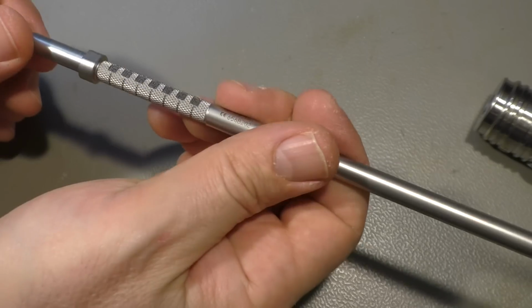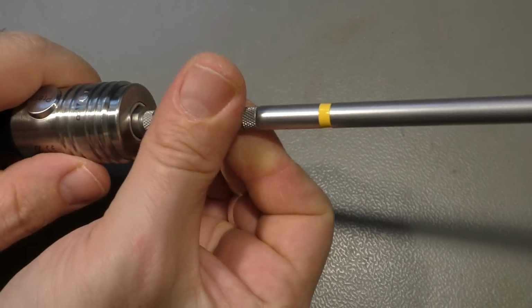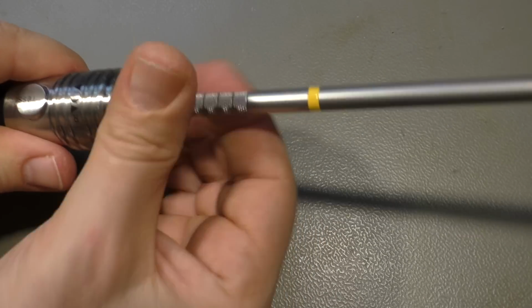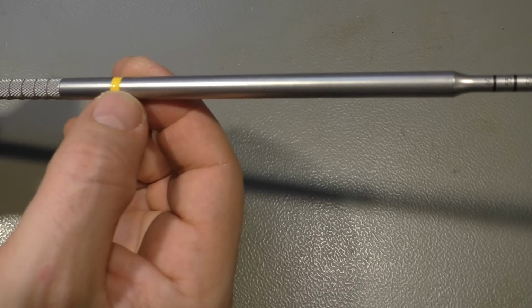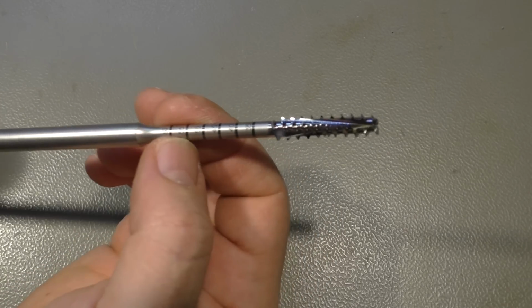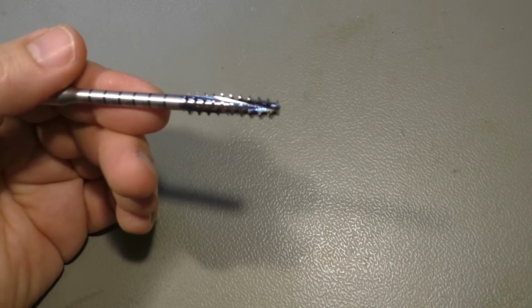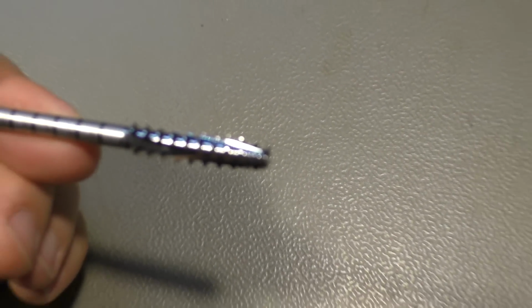Then we have these tap drill bits. They go also into this thing. And in the center position it is locked on both sides. Has a yellow marking. The others are blue, green and violet. It has a depth gauge here up to 60 millimeters. And we have, let me zoom in, maybe we can see that better.